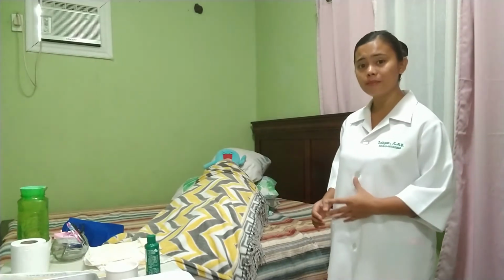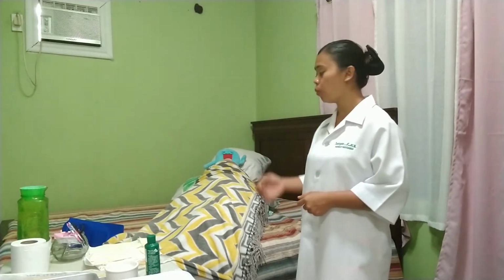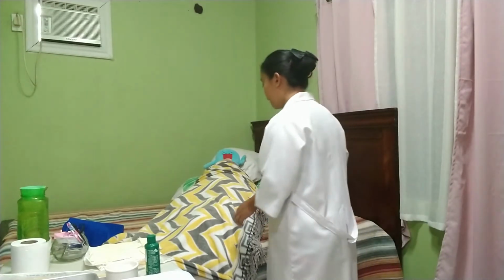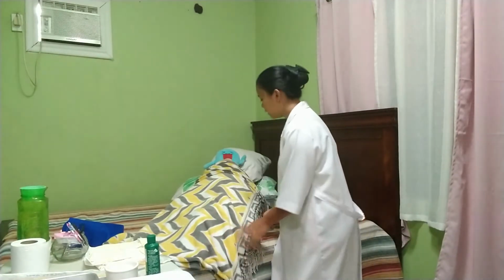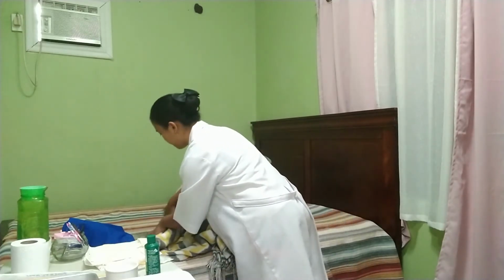The meatus is sometimes difficult to visualize because it may resemble the skin fold of the female client. For our female client, we have to put our client in a dorsal recumbent position where knees would be flexed, supine position, and feet flat on the bed. Now, if the patient is unable to follow directions or instructions, we may need help so we could protect our sterile field. Miss Angelina, I need you to flex your knees like that. Okay, very good. And feet flat on the bed.